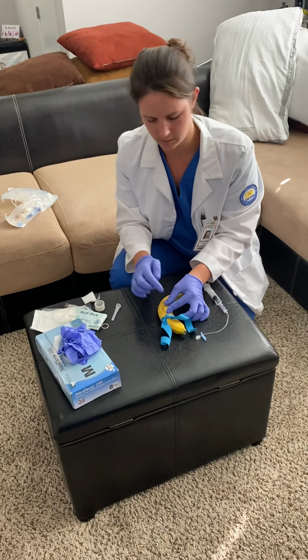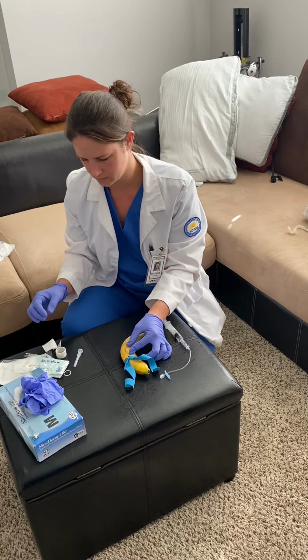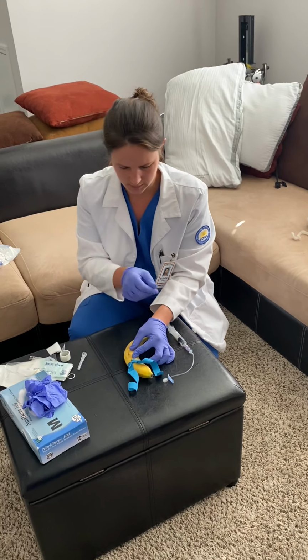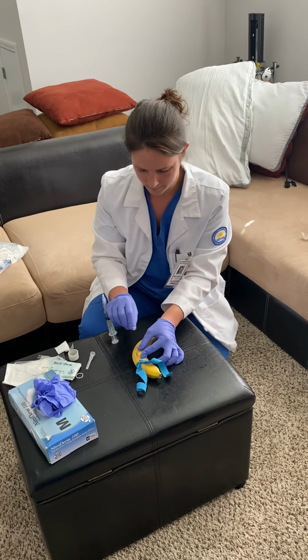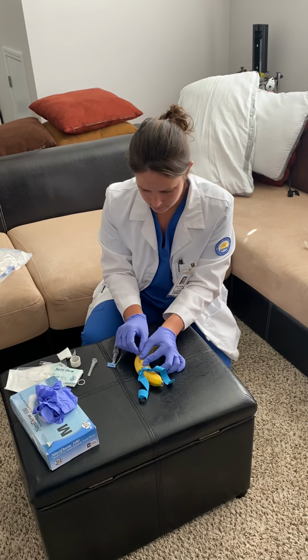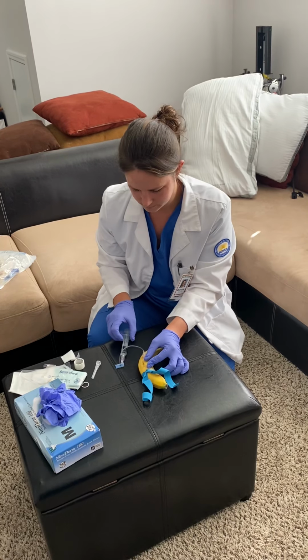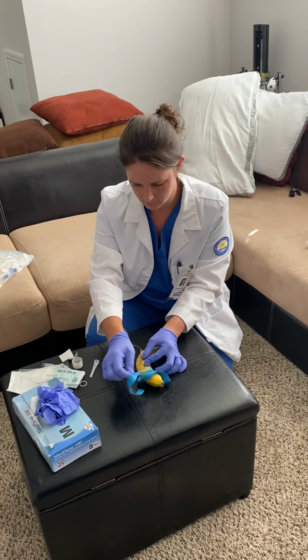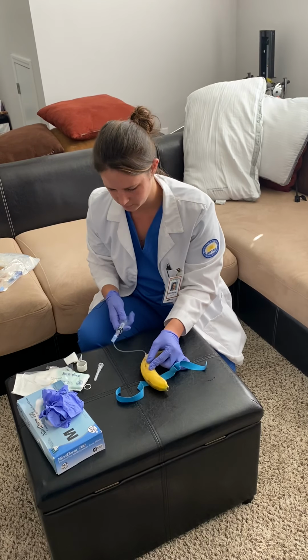Now, making sure that you keep pressure on the vein so that there's no spillage of the blood, you're going to take your saline flush and attach it. Release my tourniquet. I'm going to check the placement for patency.